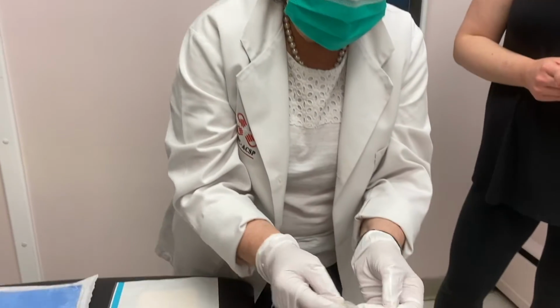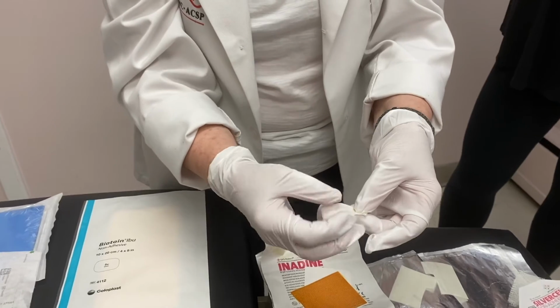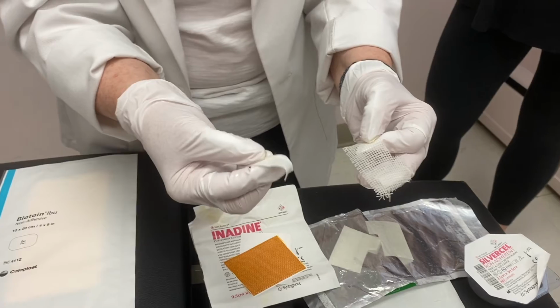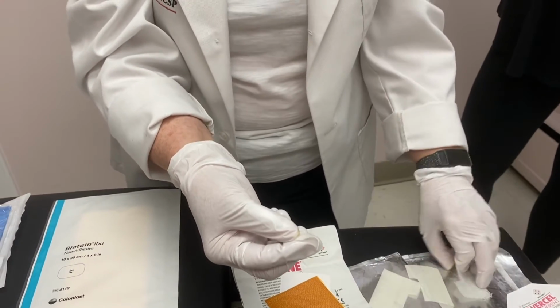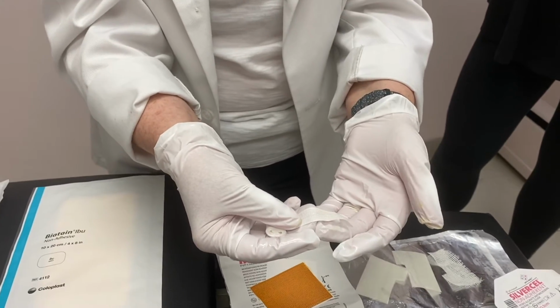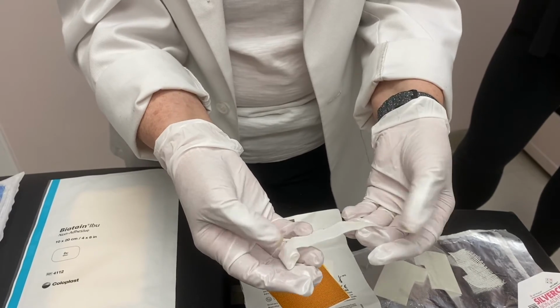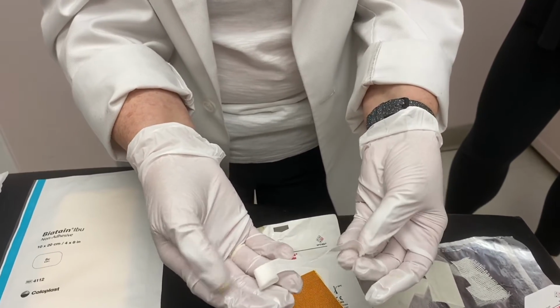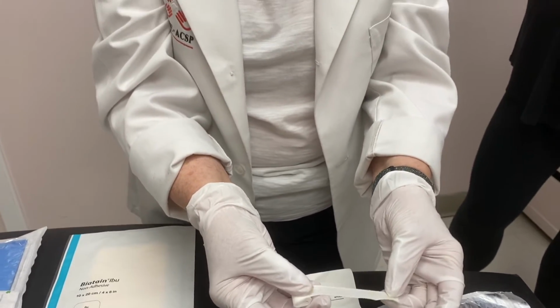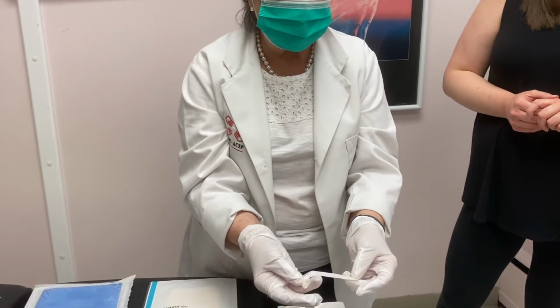And then this is called polyhexamethylene biguanide. It is a relative of this one in that it has just an extra molecule on it, but it takes the bacteria up into the dressing, and it destroys the bacteria in the dressing. This comes in every form of dressing material that you can think of. This happens to be a packing gauze. It comes in a roll gauze, a very wide roll gauze.